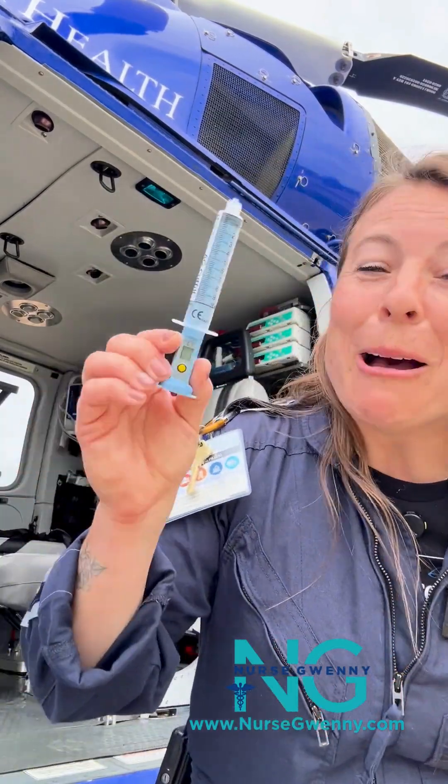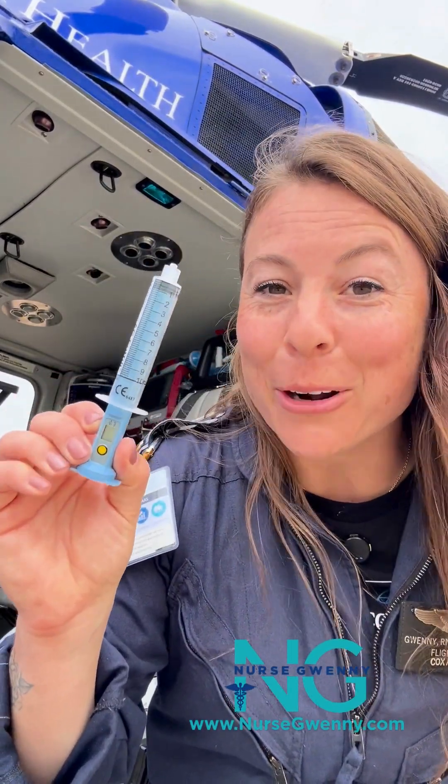Hey guys, it's Nurse Gwenny. Let's talk about why the ET tube cuff manometer is such an important piece of equipment and why we should be using it on every single intubated patient to make sure that we're not causing harm.